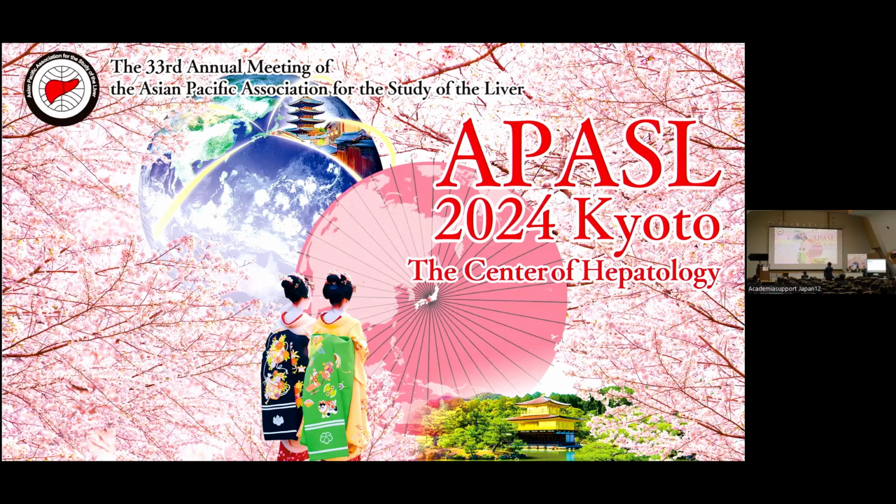I'm Matsubara from Saitama Medical University. Thank you for your good presentation and good study. I have one question. I think the cause of RBO is different in plastic stent and metal stent. In plastic stent, bacterial biofilm or sludge is a major cause of obstruction. However, the metal stent is mainly obstructed by tumor ingrowth. So I have one question. Was there any difference in the number of cholangitis patients or the prior drainage placement between both groups?